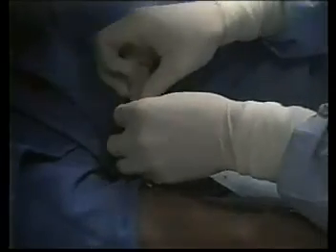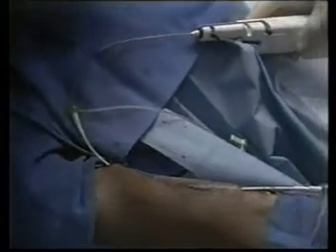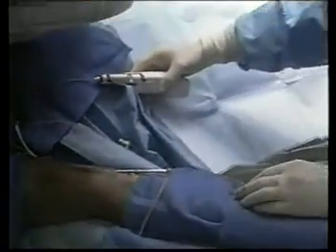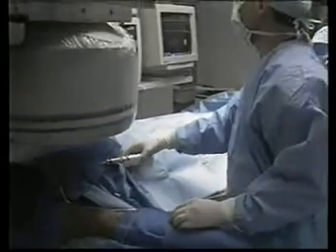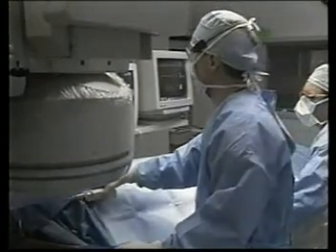With the fragmentation basket in the compressed position, insert the catheter into the arterial limb of the graft. Advance the tip of the fragmentation basket up to the arterial anastomosis. Do not advance beyond the anastomosis. Expose the fragmentation basket and activate the rotator unit. Slowly withdraw the rotating fragmentation basket along the graft to break up the clot.